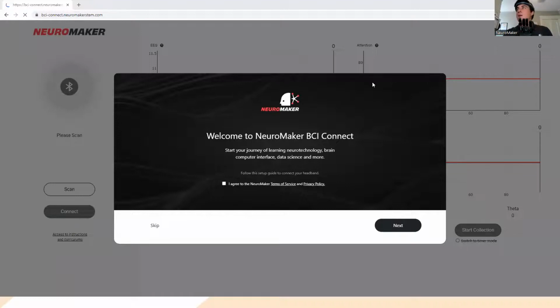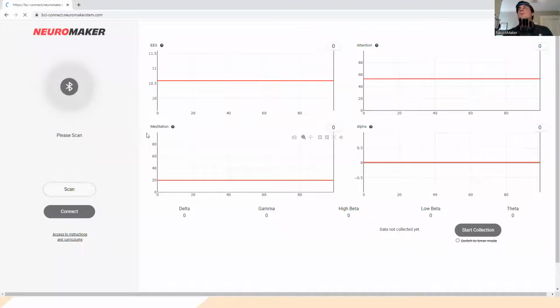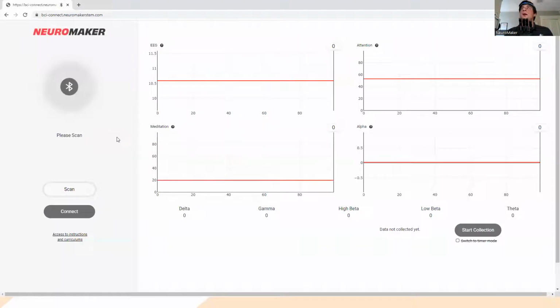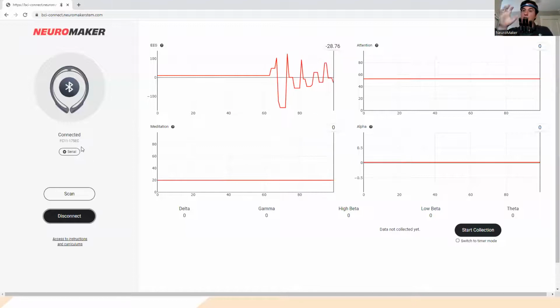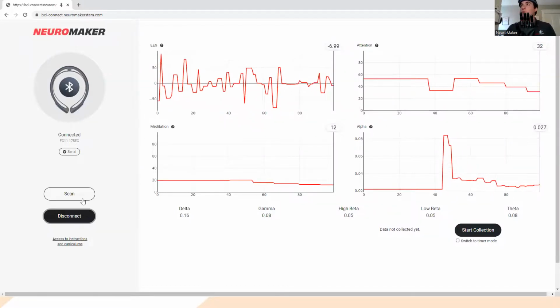I'm going to connect my headband here, and we're going to see this move live. Once again, this is just the way that we have these things set up, but you can set these up in all kinds of different ways too. We've had other projects in the past where people could focus in to grab certain things if they wanted to. We actually use this on the prosthetic side of our business to control other things, like taking muscle signals and then being able to use those to help an amputee control their prosthetic arm. But today we're going to use brain signals to control those different gestures.